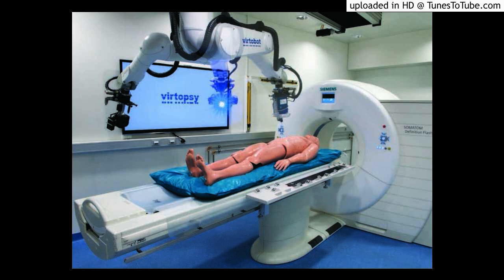This method uses a biopsy gun to obtain samples of organs of interest, for example, the heart, or specific pathologies seen in CT or MRI. It also aids in collection of tissue and fluid samples that can be collected for toxicological and microbiological examinations. Besides the manual sampling, image-guided sampling with a dedicated robot has been introduced recently.